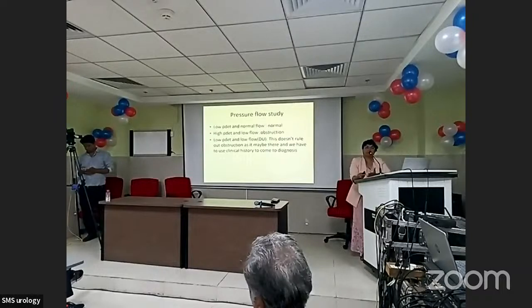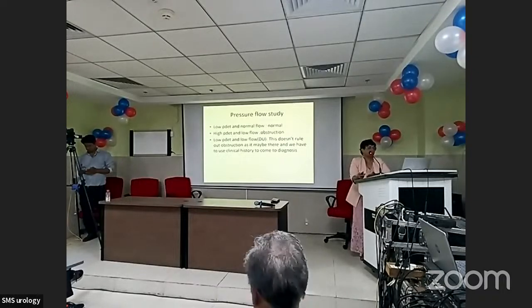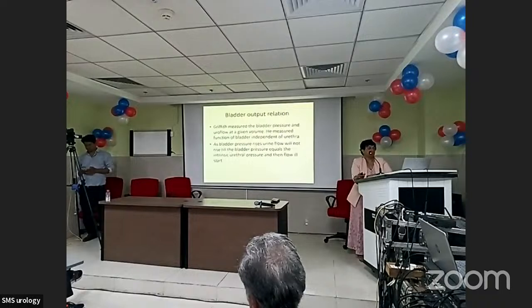What is happening? Is there obstruction or is there no obstruction? Should we operate or should we not operate? And what should we advise the patient about the outcome? Here, always remember, we have to use the clinical history, what the patient tells you. That is rather the most important feature, which will tell you what decision we should take about such a patient.